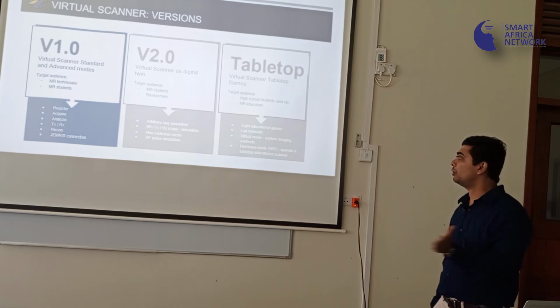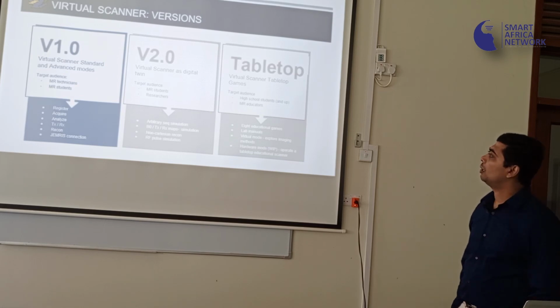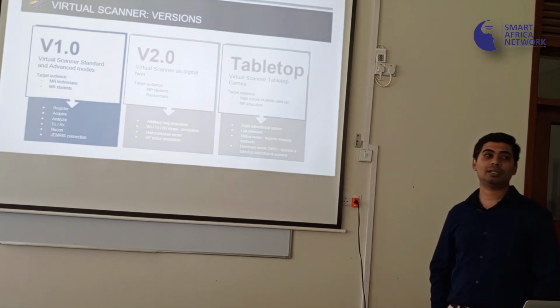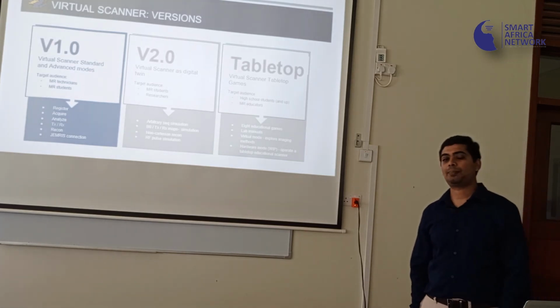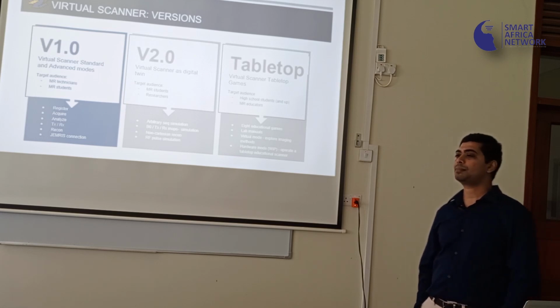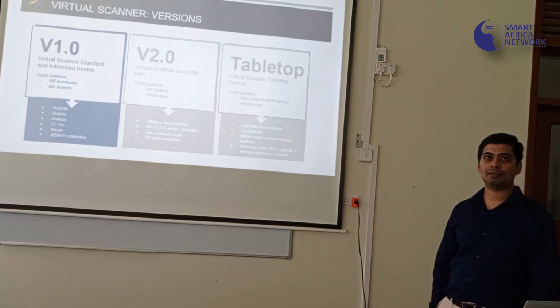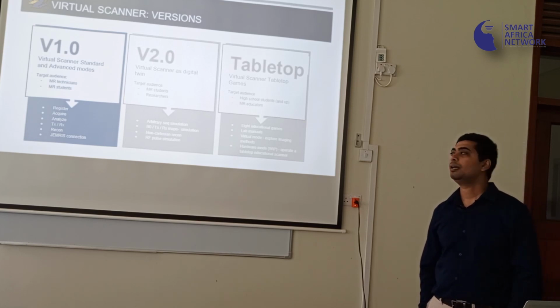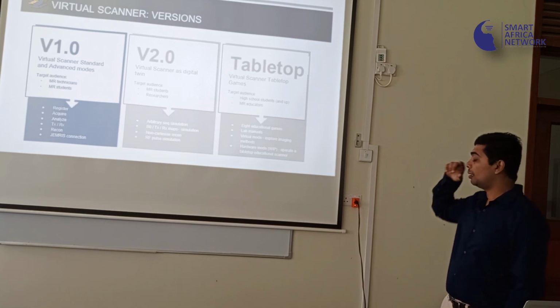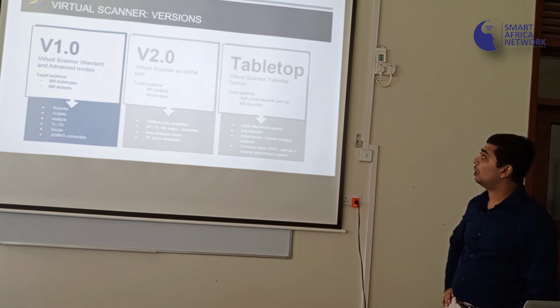We've gone through two versions now, and we are now also integrating this with another education scanner called the tabletop scanner, which is at 0.40 T, has a small 10 mm bore, and comes out from MIT and Harvard. We have some colleagues there. So we are also plugging in with that hardware so we can play that on the education scanner.